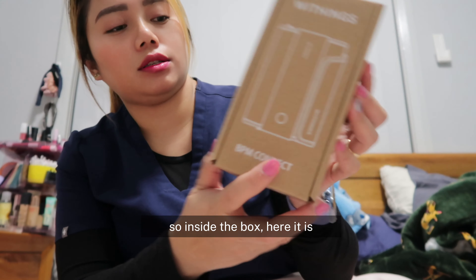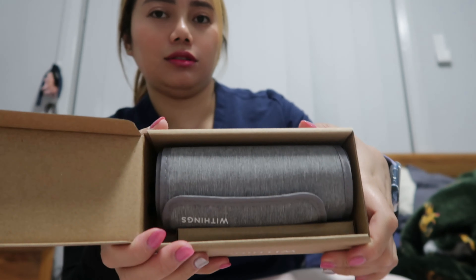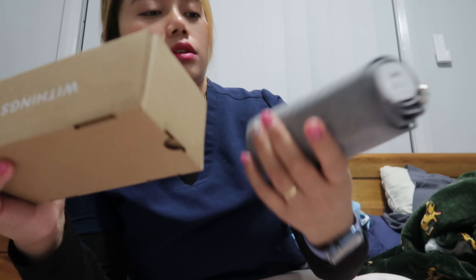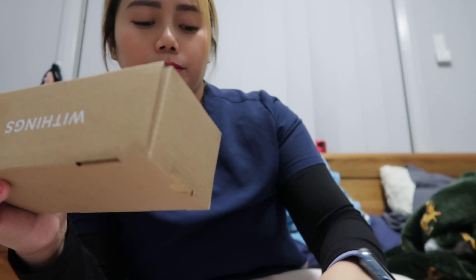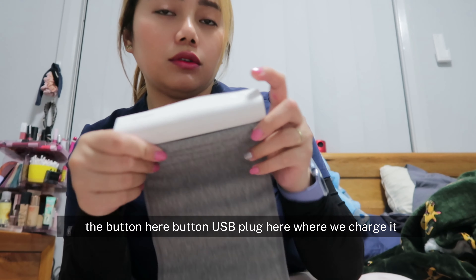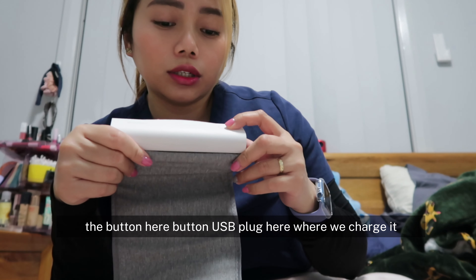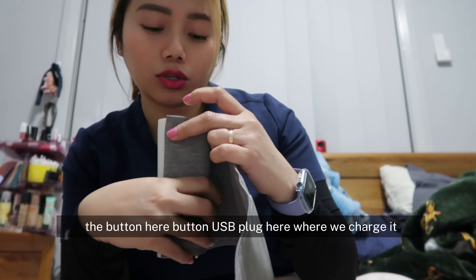Let's open it. Inside the box we have the blood pressure machine itself, the USB cable, and paperwork or user manual. There's a button here, a button here, another button, and the USB port here where we charge it.